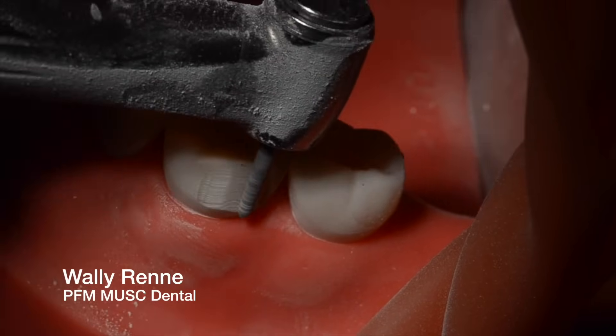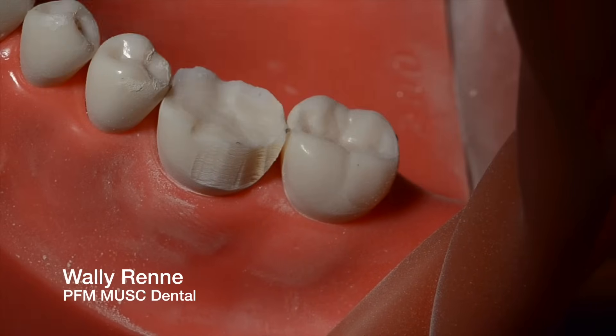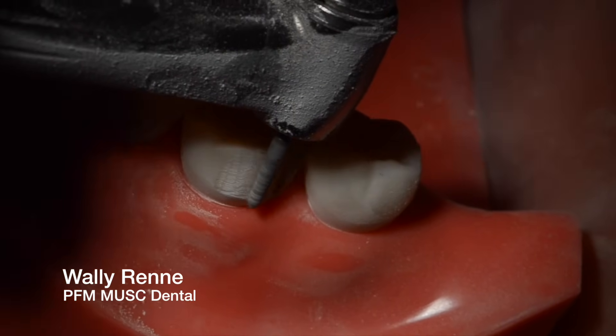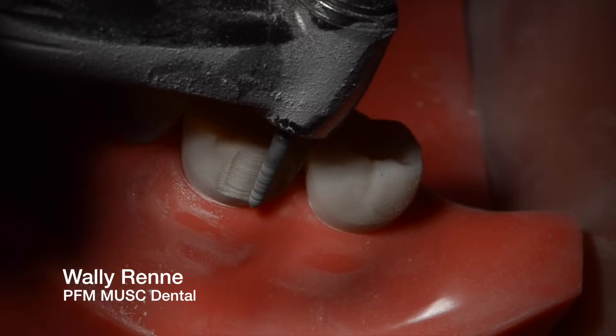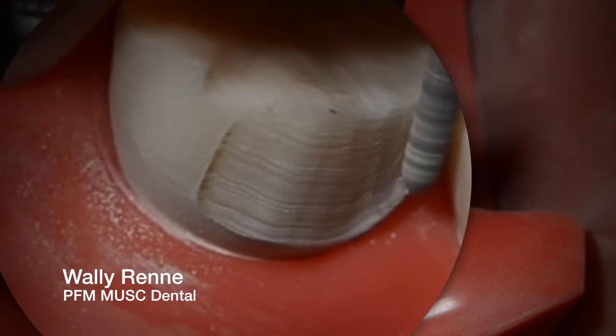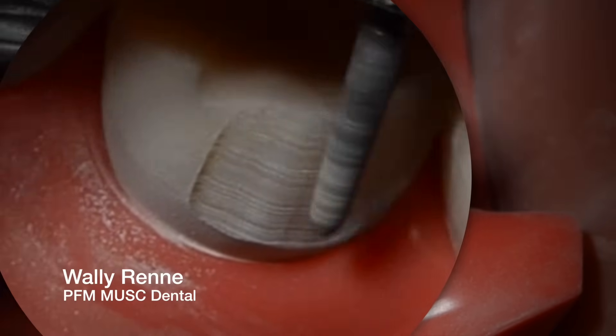Just go ahead and start focusing on your finish line. By definition, if you hold your bur parallel to the long axis of the tooth and you've given me a 1mm chamfer, it's almost impossible to under-reduce your axial wall. So I'm just focusing on my finish line here, trying to get a heavy chamfer.